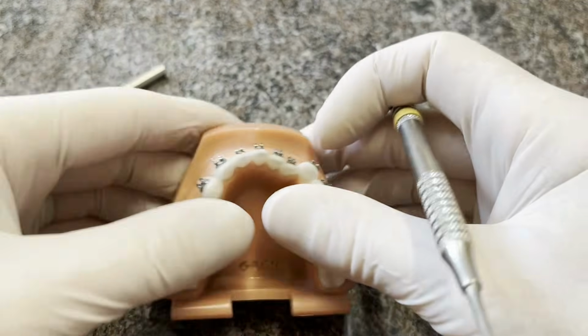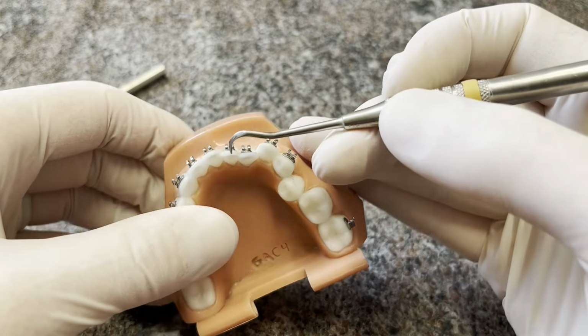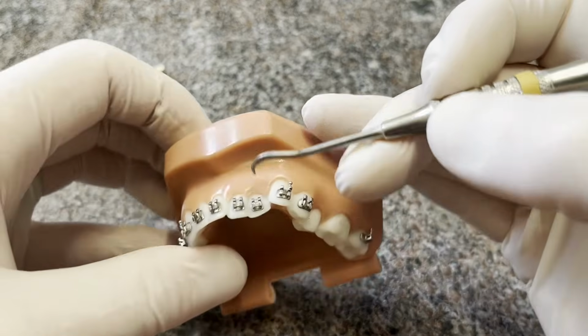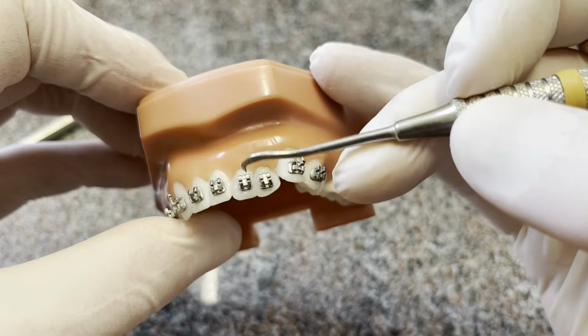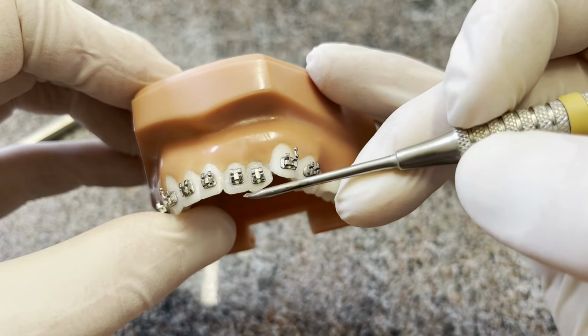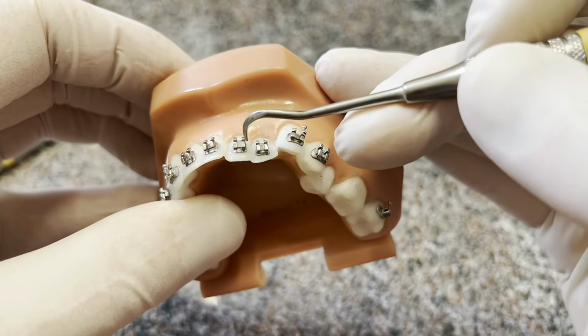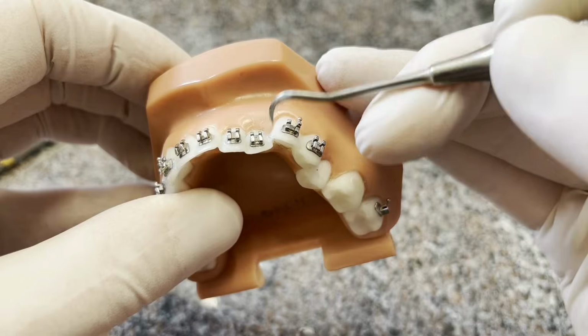And if the tooth is crooked, you're still looking at the same things. It's by individual tooth. So just make sure that that slot is parallel to the incisal edge of the tooth. Make sure that your bracket is parallel to the long axis of the tooth, and that it's about 2 millimeters away from the edge. And then you seat it into place. You clean up your flash. Make sure that it's seated back in if you moved it when you're cleaning the flash, and then you go on to the next one.